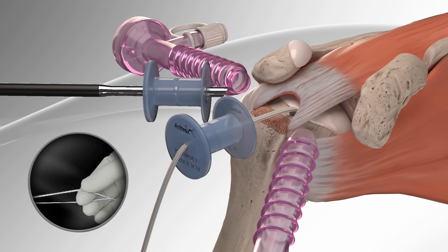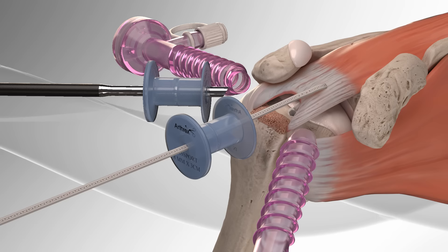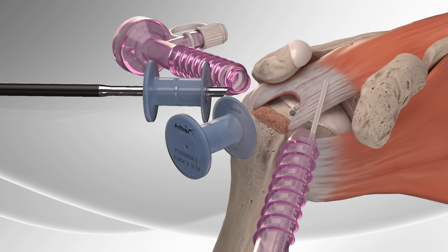The Fast Pass Scorpion is used to pass the fiber tape through the rotator cuff and retrieve it for use later. The step is repeated for the second anchor. The fiber tape loop is trimmed at the splice to separate the tails.